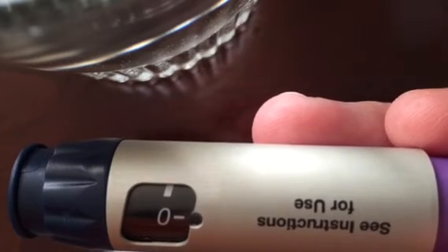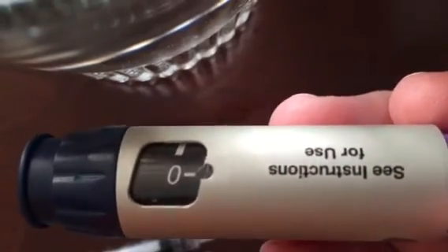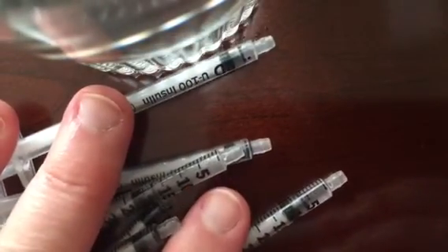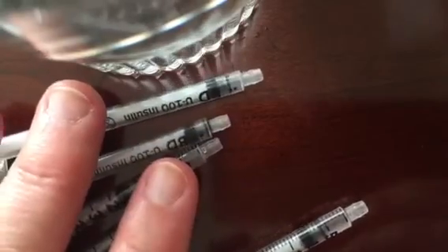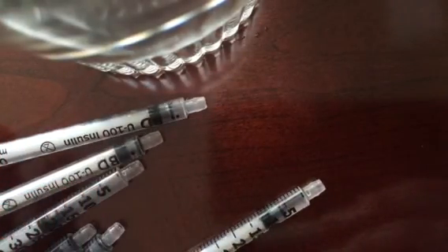However you end up doing it. Some people do 5 in the morning, 4 at night. They don't typically split half and half from what I've been reading. So I just want to research the clicks, if they're consistent, if 1 click consistently delivers the same amount. So that's what I'll do next after I test the syringes to see that each daily dose is between 6 and 7 units, which is what I got this time with this test. I'm gonna test it 3 or 4 more times to see if it consistently does the same.